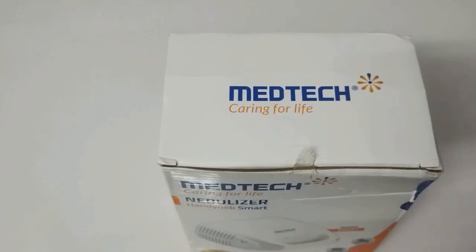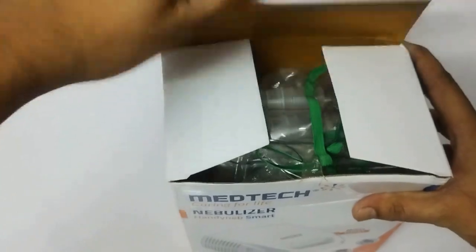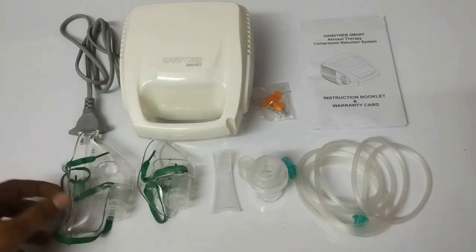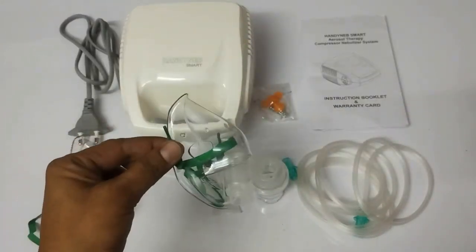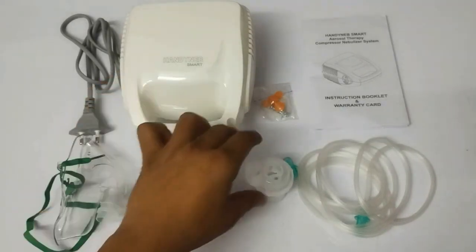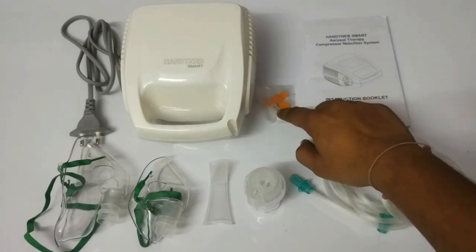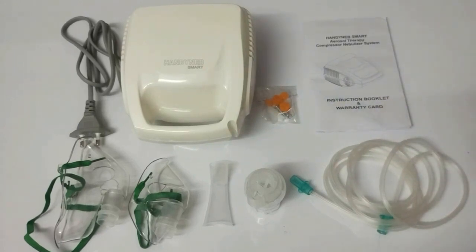Now we are going to unbox this product. Inside the box we have the Medtech Handy Nap Smart Nebulizer itself, one adult mask, one child mask, one mouthpiece you can directly take into your mouth and breathe through, a medication bottle where you can pour the medication, a two-meter long tube, two filters for the product, and a user manual — an instruction booklet to help you use the product.